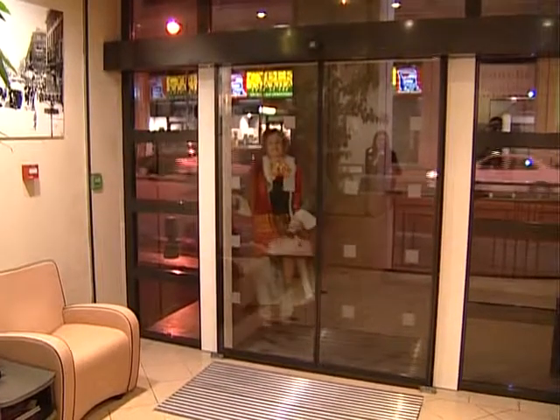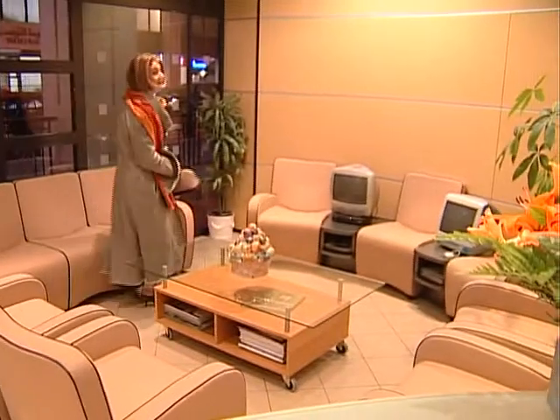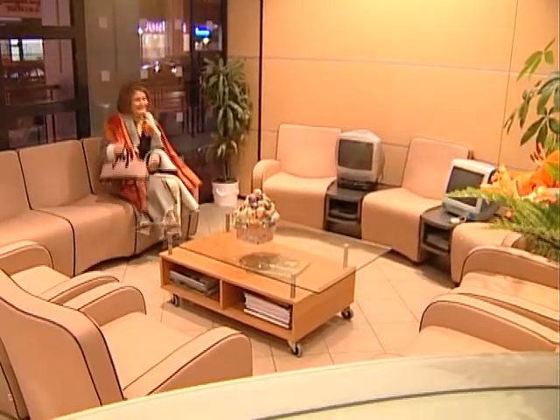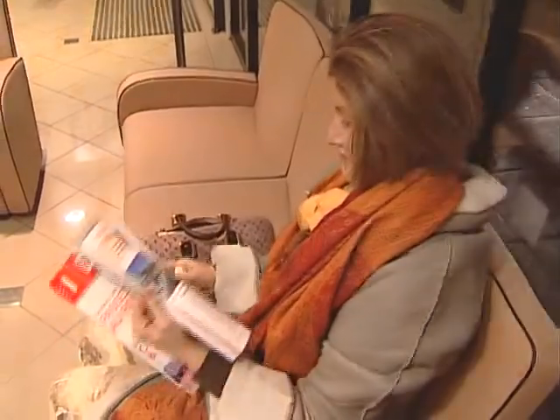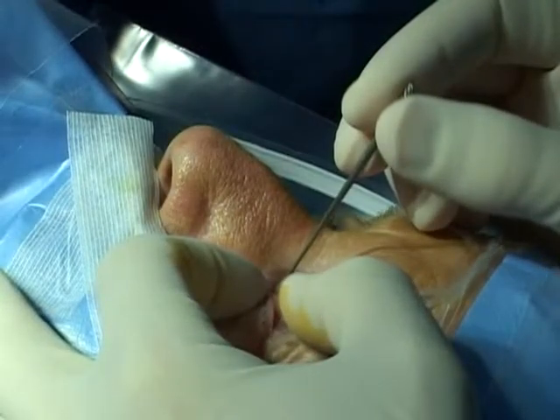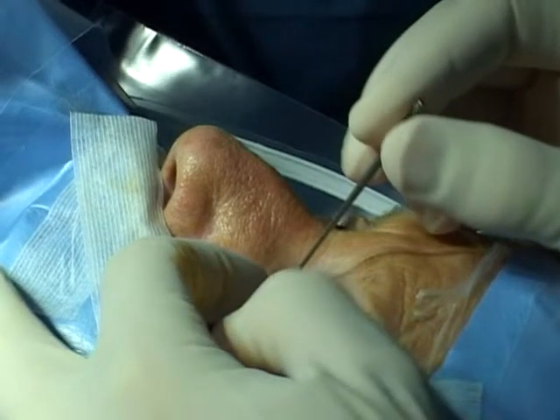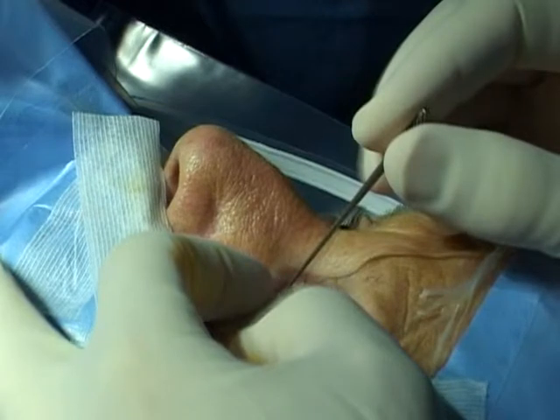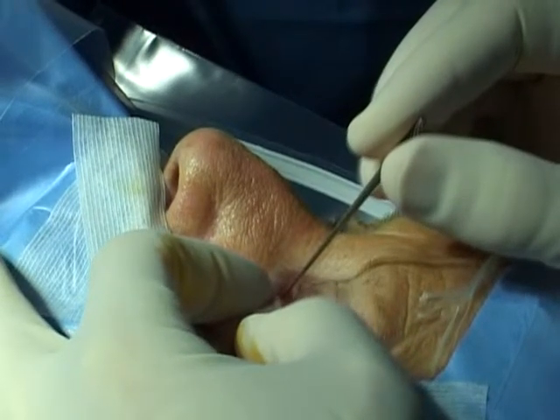Tearing is an annoying and embarrassing pathology which is an increasingly popular reason for arranging a consultation. There are many etiologies, with patients often presenting narrowed or obstructed lacrimal ducts. Bicanalicular, monocanalicular and mini-Monoka intubation devices have been available for many years and offer proven efficacy. These devices still offer excellent therapy for our patients.